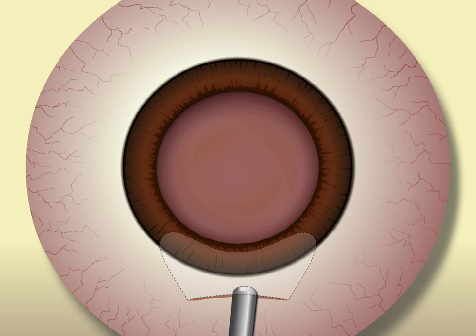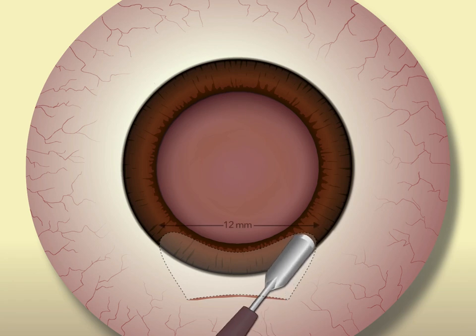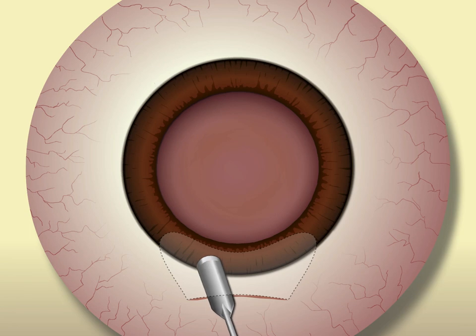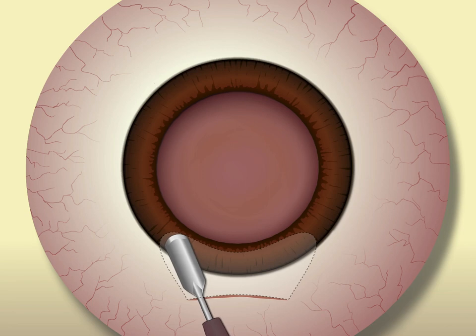The internal corneal incision is best made with a bevel-up crescent blade with the goal of creating a funnel-shaped incision. The cord length of the internal incision should be approximately 12 mm. The trick to creating this large internal incision is burrowing laterally into the peripheral cornea and slightly under the limbus on both sides of the internal incision.